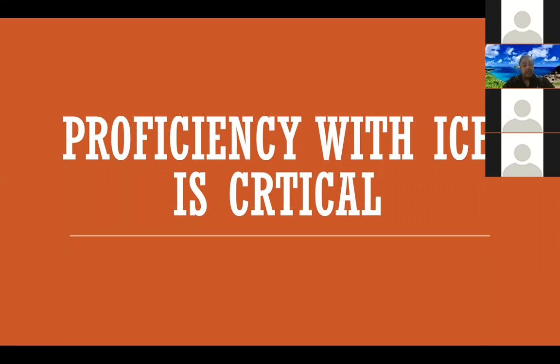Now, if you look at someone like Brett Gidney, when I saw his ICE skills, I was like, I can't ever do this. He's able to map out small tributaries of coronary arteries with ICE. He's just sort of a Jedi master with it. I found that to be very intimidating. So my ICE protocols aren't as heavily influenced by ICE usage as his are. But that just goes to show that there are lots of different ways to skin a cat. The technology is such that you can choose many different ways to reduce your fluoroscopy. No matter what you do, though, ICE is going to be critical.